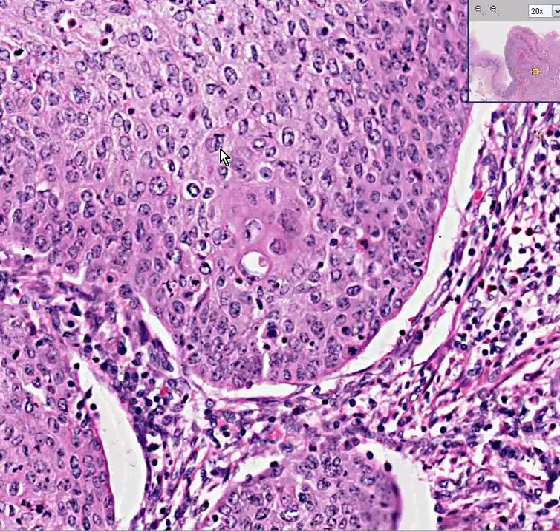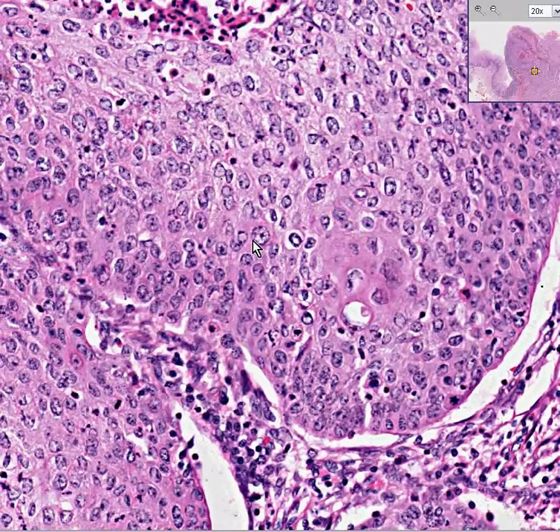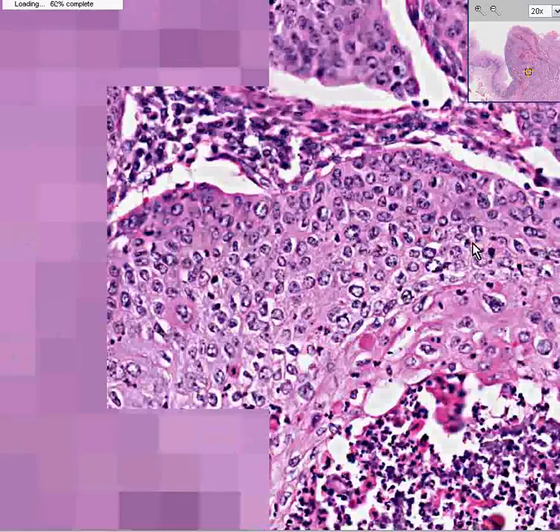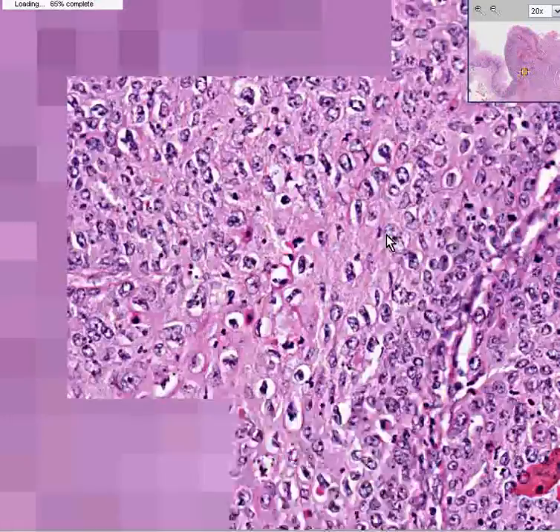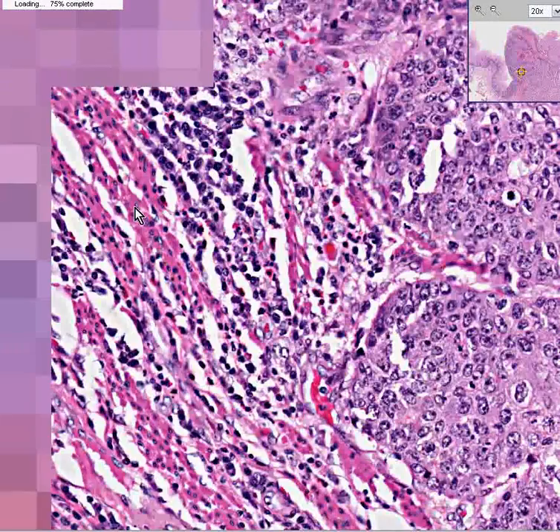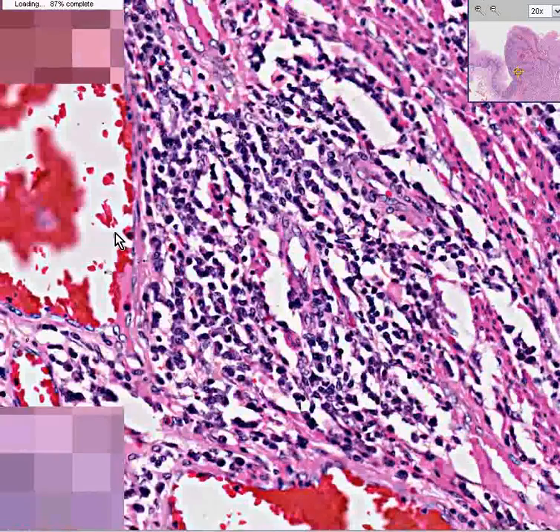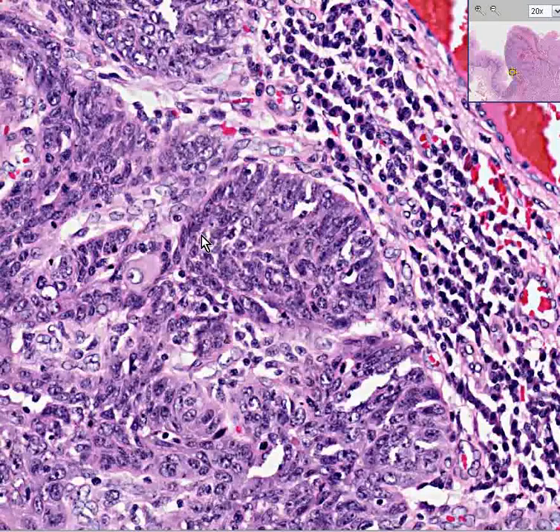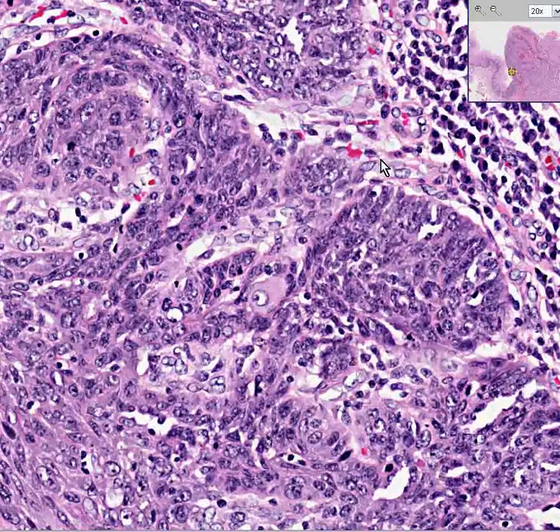There's sometimes abnormal mitoses. They're dark. They're lumpy. They're irregular. But they don't seem to look as bad, theoretically, as the in situ cancer, which we see over here, does it? The in situ stuff actually looks nastier and bigger and darker.